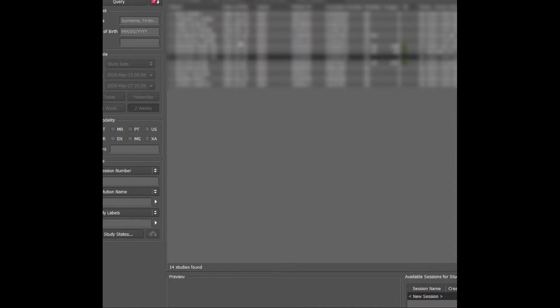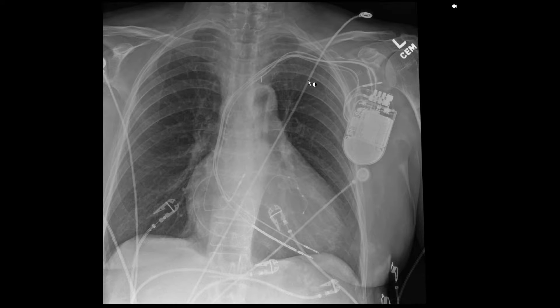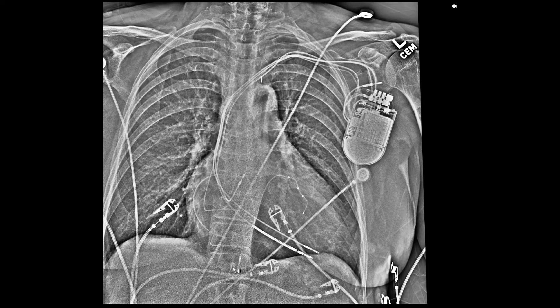Here is an example of a balloon pump inserted through the axillary approach. These balloons tend to have two radiopaque markers — one on the cranial end and one on the caudal end, which are more visible on an edge-enhanced image. The balloon is partially inflated on this radiograph. The cranial marker is in the subclavian artery, which is acceptable since that is above the level of the balloon. The balloon itself is inflated in the distal arch or proximal descending aorta, not in the subclavian artery, which is important as inflation there could cause ischemia.